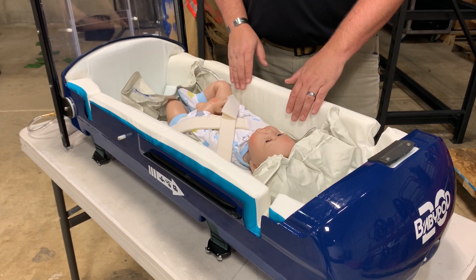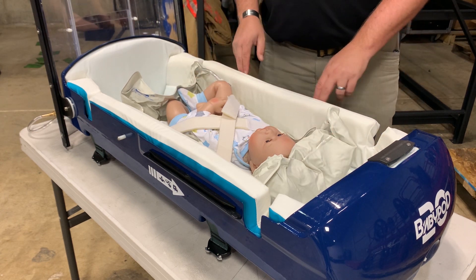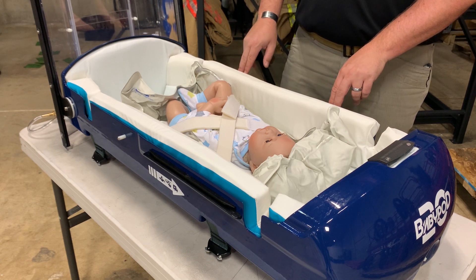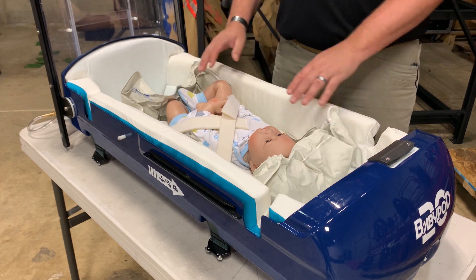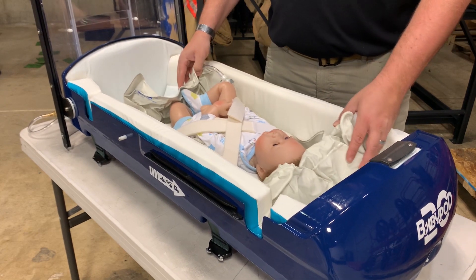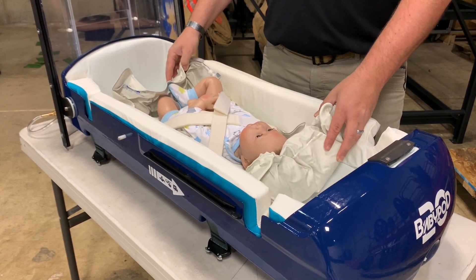Next, we have straps which thread through the vacuum mattress. These straps are connected directly to the structure of the BabyPod, but the primary purpose of these straps is not to really restrain the child. The purpose is to simply keep them in position with a little bit of leeway and give, so that if there is a crash, it's not a sudden jarring impact.